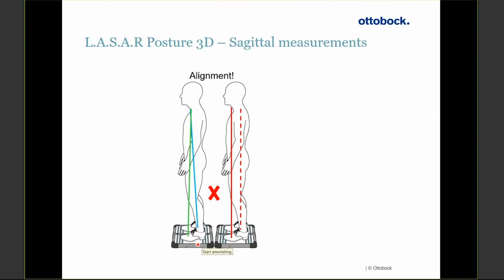And this is purely for safety. We just want to make sure that when the patient stands for the first time in their prostheses, it's not going to collapse on them. So often when you come straight from bench alignment, you might have this little situation here, very easily solved by a little alignment change.